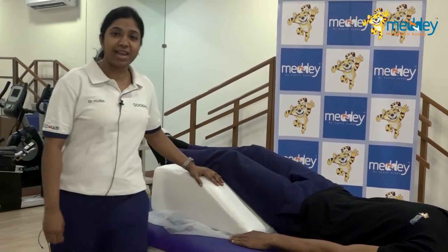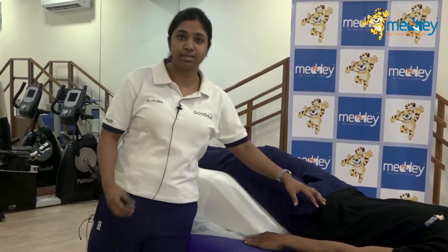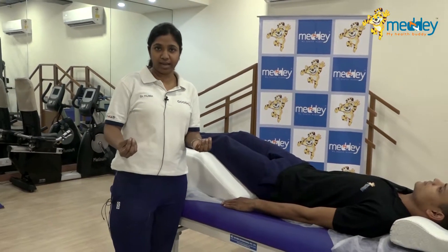In this particular video, I'll be telling you how to use a wedge in order to take the strain away from the back. This wedge can help you to alleviate back pain or back strain which happens from day-to-day life.